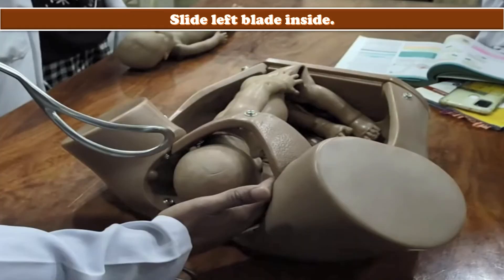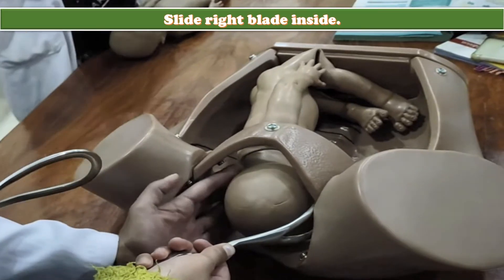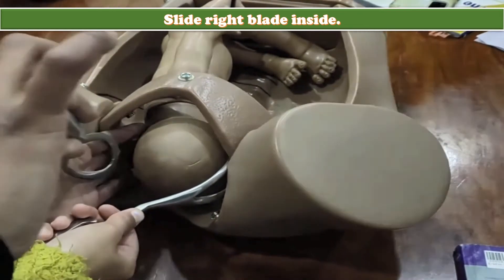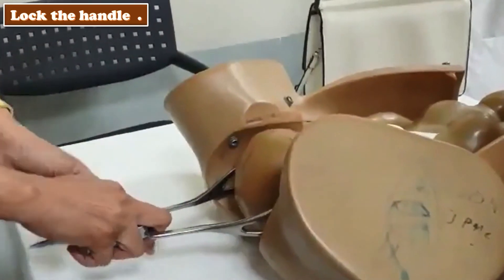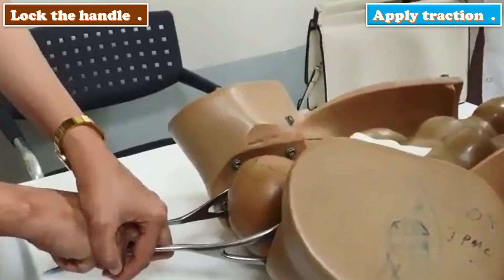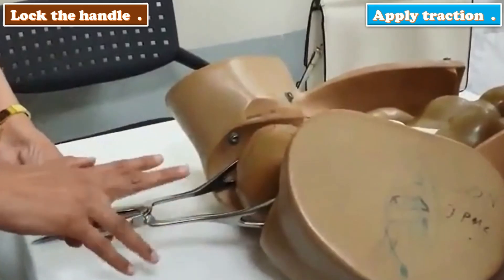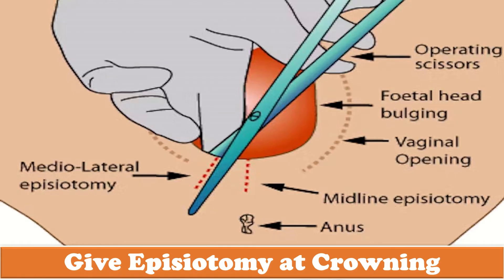I will guard the vagina with my right hand and slide the left blade downward between the fetal head and the right hand so that the handle comes to lie in the horizontal position. Then I will lubricate the right forceps, hold it in my right hand, and apply it in the same manner. I will lock the handles, which should be lying horizontally if applied correctly.